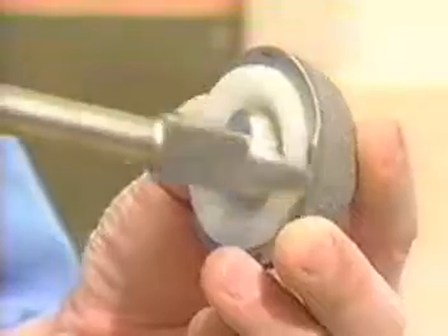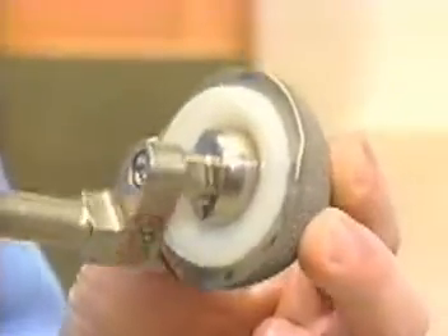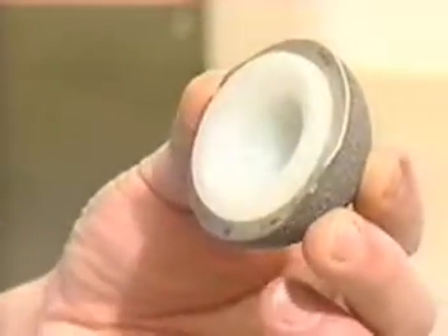It goes around. The short blade will circumferentially remove the bone around the rim, keeping that nice acetabular rim.